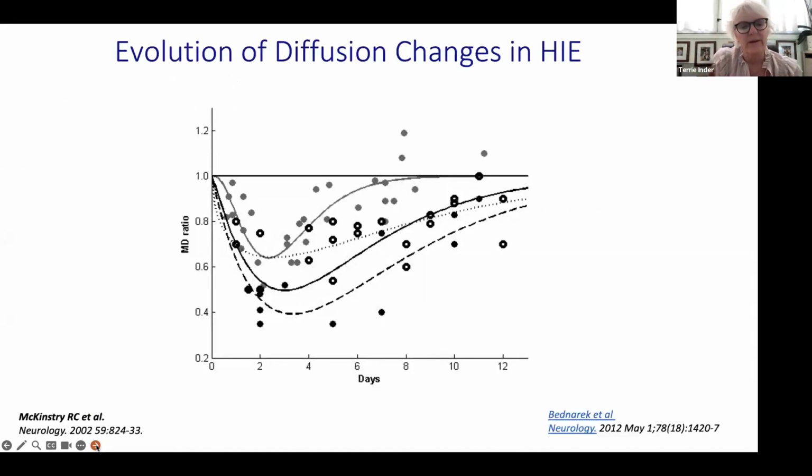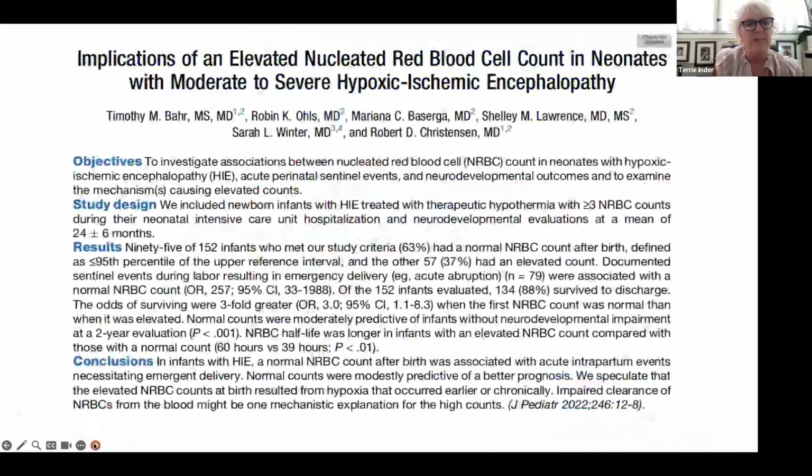So just to reiterate again, remember these time windows: normothermia, which is rare now but can occur, and then hypothermia, where we are trying to look for this maximal decrease. So it's pretty rare we will try to ever do any imaging in the first 24 hours, because just like after 7 days, that first 24 hours can underestimate the extent of the brain injury.